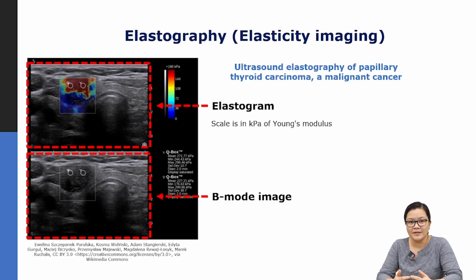Now, elastography in general, another term for it is elasticity imaging. So imaging the elastic properties of tissues. Now it's more like imaging the mechanical properties of tissues, because we don't only get the shear modulus, we can also plot the map as a function of the shear wave speed as well as viscosity.